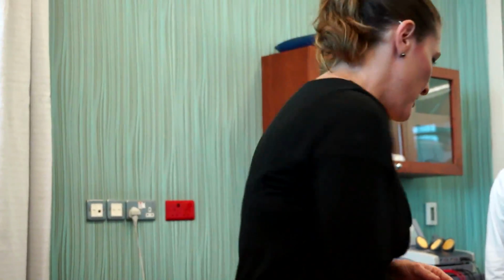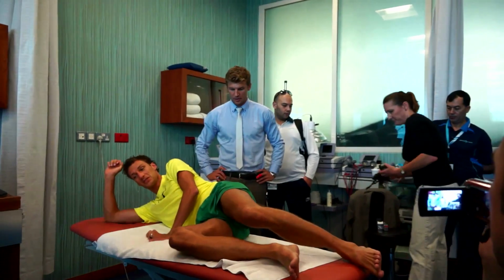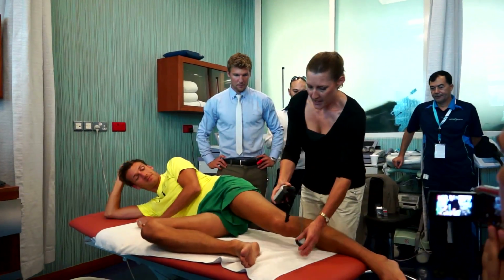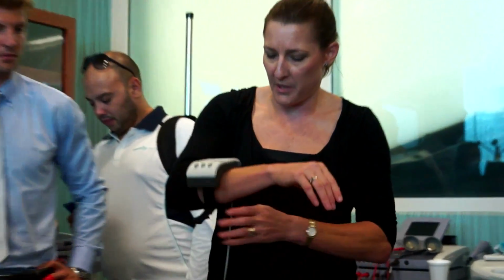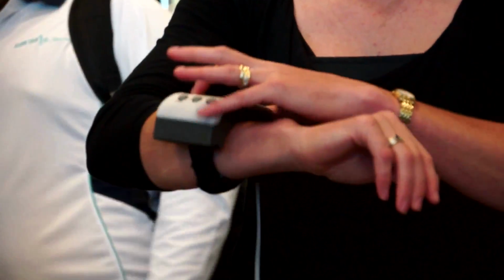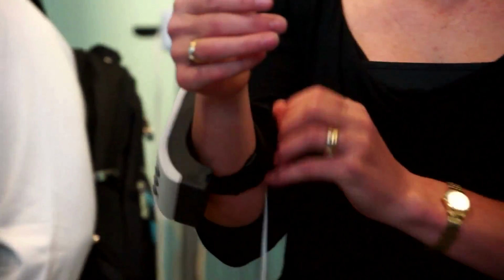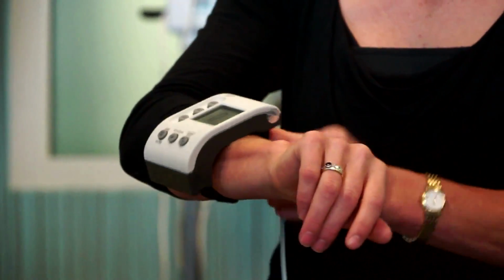Okay, so now we go on to the strength measures that we did. We chose to use the Power Track, which, as you saw in some of the presentations yesterday, is being more widely used throughout the world. It's fairly portable, or very portable, and easy to use device, and relatively inexpensive as well. So in clinics in Australia, there's a lot of people purchasing the Power Track.